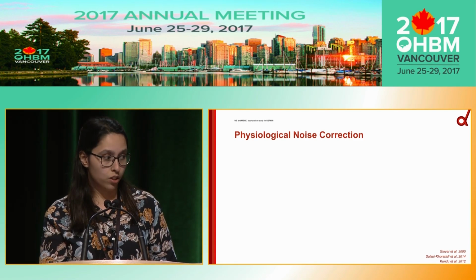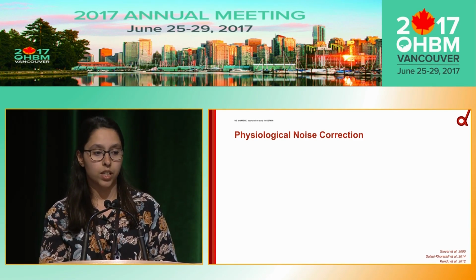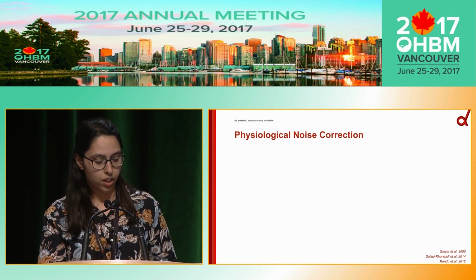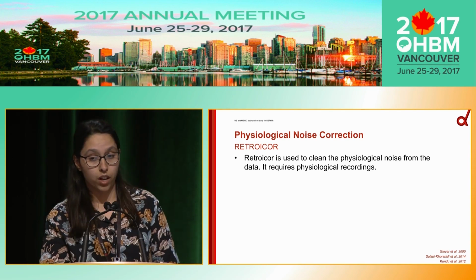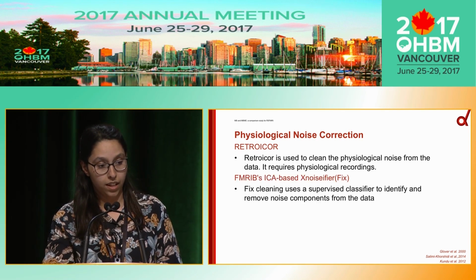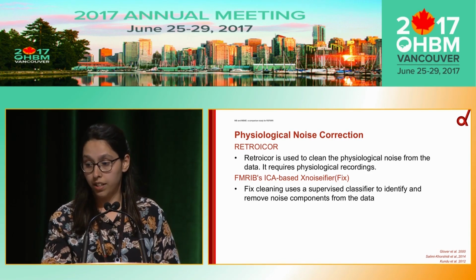A bit on the physiological noise correction, because I will be dealing with how different sequences might be affected by using different kinds of physiological noise correction. The most common method has been RETROICOR. It's an image-based cleaning method, and during this, you need extra measurements during the scanning. The next one is FIX, commonly used today for cleaning multiband data.